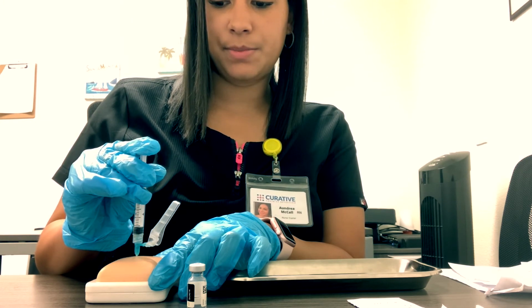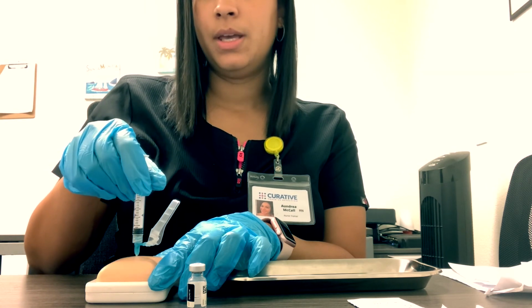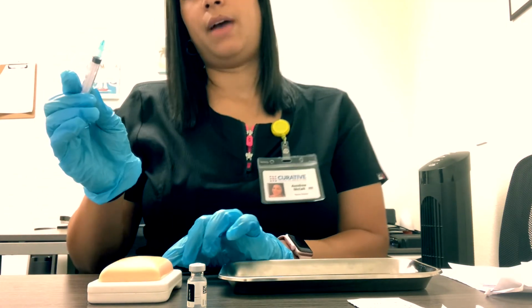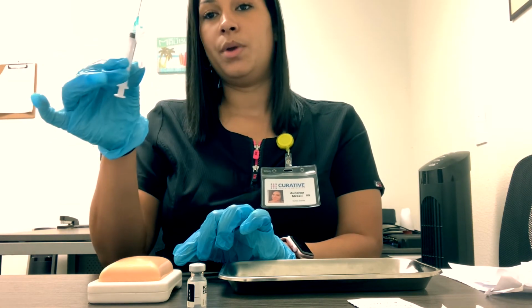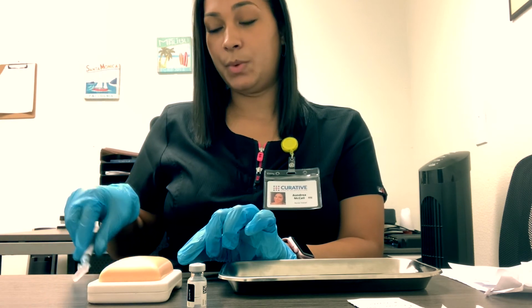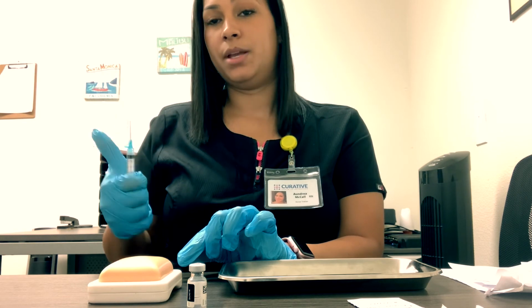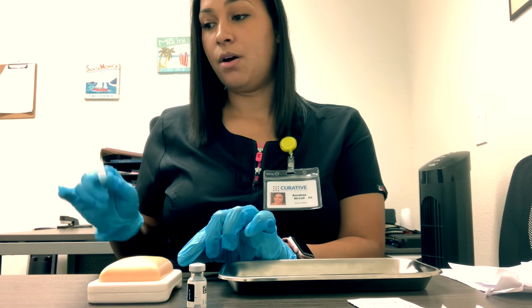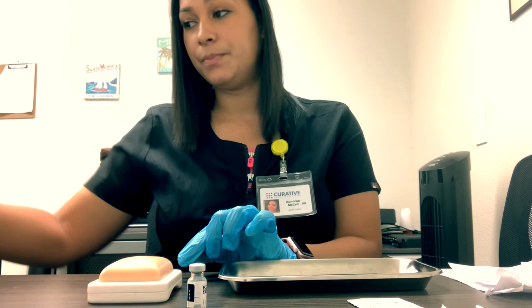After the vaccine has been fully administered, you want to just wait a couple seconds. So 1, 2, and then you would pull out at a 90-degree angle. Once you're done vaccinating your patient, this needle is your first priority. We are going to activate the safety lock on a hard surface. We never activate the safety lock with our fingers, because that way we can make sure that we are preventing needle sticks. So you're going to activate your safety lock on a hard surface, and then you would go ahead and drop it into the sharps container.